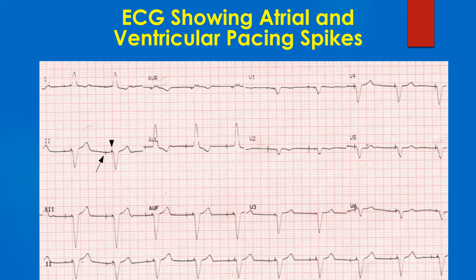This suggests a ventricular pacing site at the right ventricular apex, or right ventricular apical pacing. A similar pattern with normal QRS axis would suggest pacing from the right ventricular outflow tract region, or RVOT pacing.